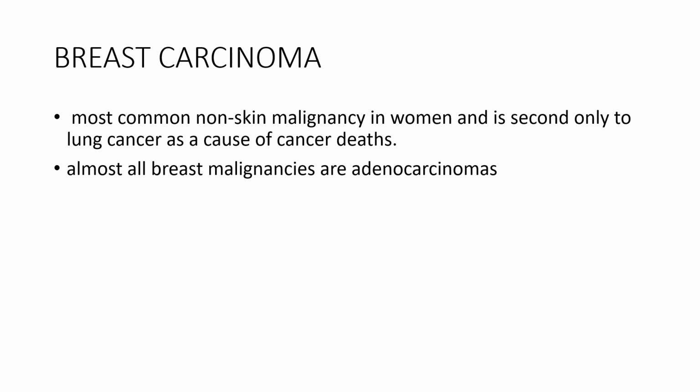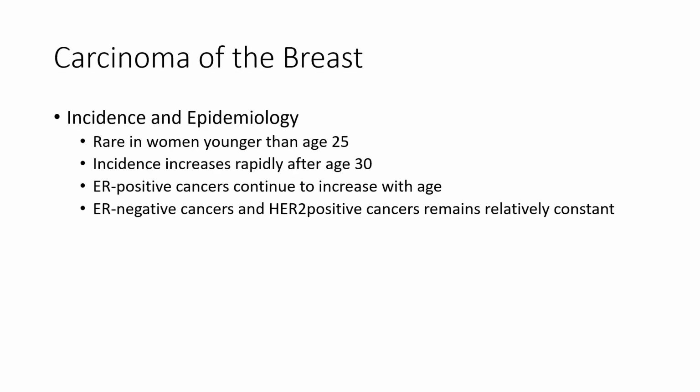Almost all breast malignancies are adenocarcinomas because the breast tissue in itself is a glandular tissue. Carcinoma of the breast per se is rare in women younger than 25, but incidence increases rapidly after 30.